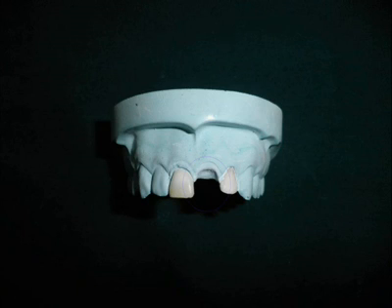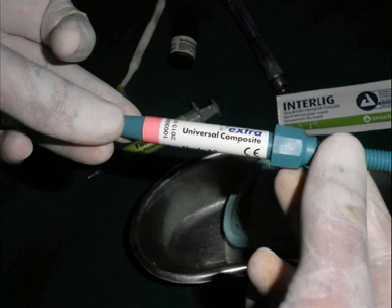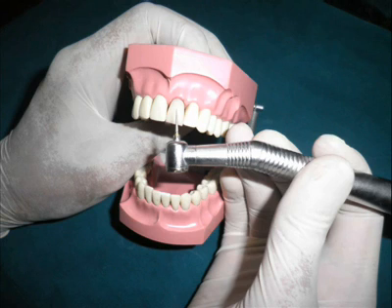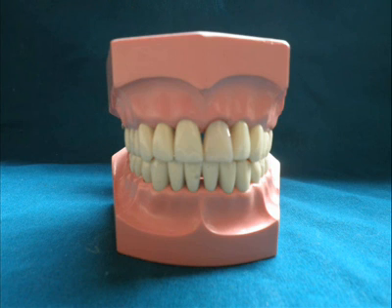The pontic can be built using two methods. Composite material is used to build the pontic layer by layer and light cured subsequently, and finishing, recontouring and polishing is done followed by occlusal correction if any.